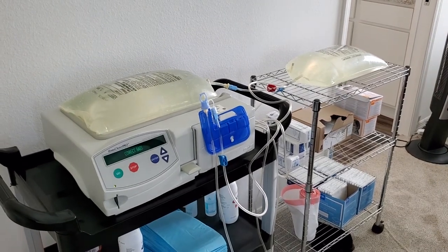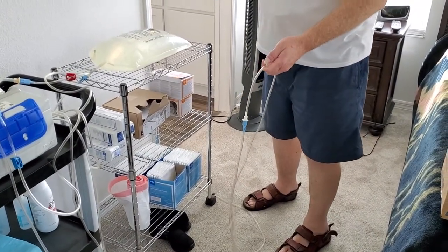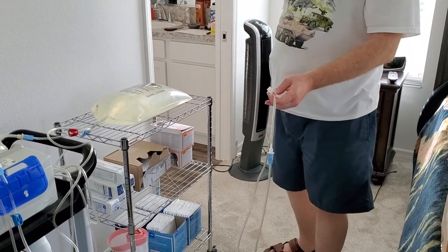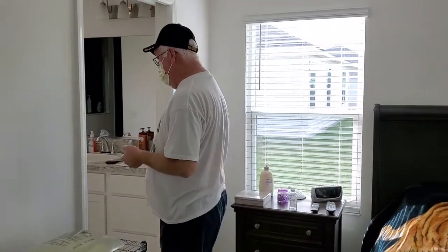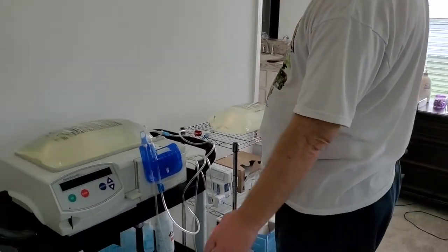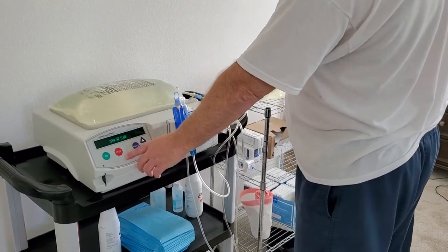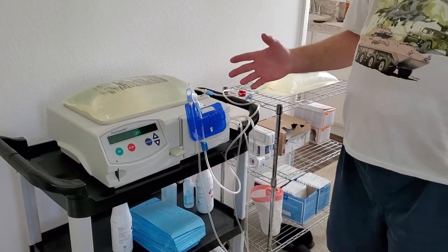One thing I want to make sure you remember is this third clamp down here on the floor. I did those two, but this one needs to be open too — if not, you're going to have a bad day because it's not going to prime right. What I've also gotten used to, before I actually connect to the machine: you can always hit stop, down, and the enter button twice and it will reprime the machine for you.